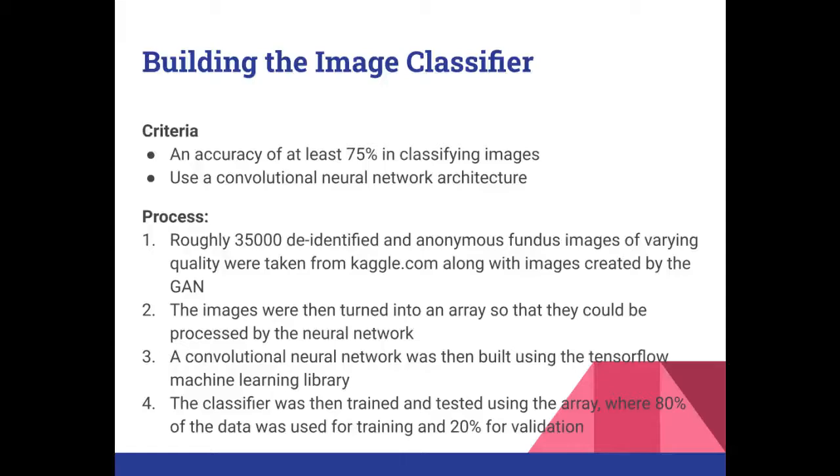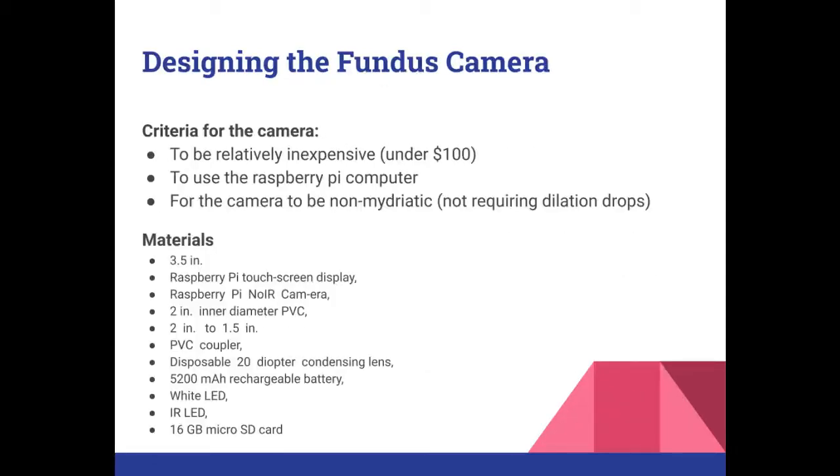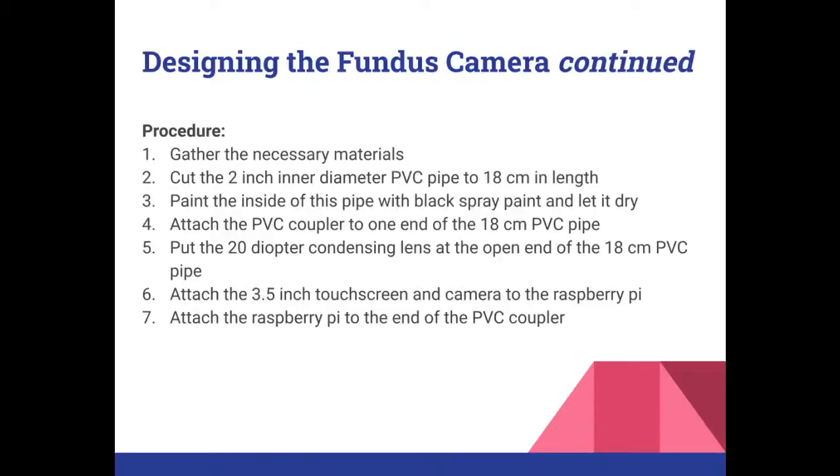And now we move on to the fundus camera. Again, I wanted it to be inexpensive, use a Raspberry Pi computer, and be non-mydriatic. The materials are shown here, and to create the fundus camera, the process is shown here.